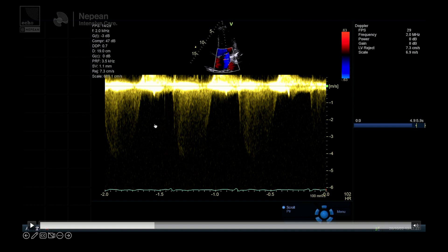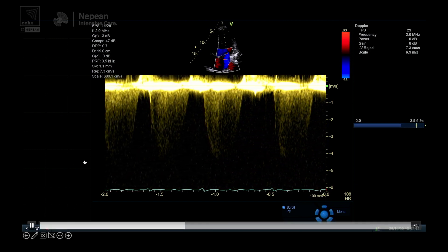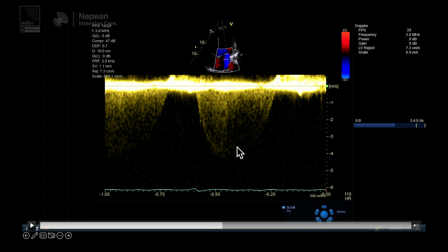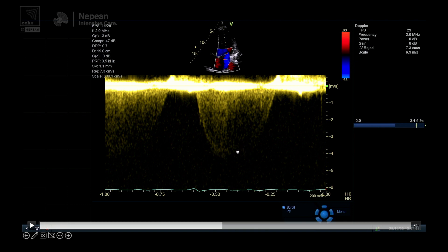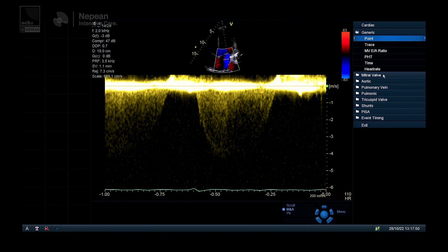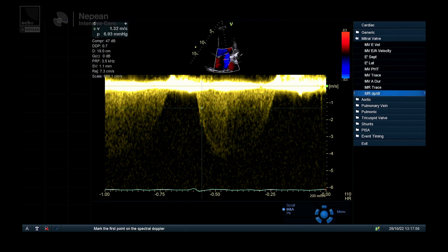I've already raised the baseline up so the negative tracing goes downwards, paused the image, and scrolled back to find a nice MR jet. This is a relatively okay jet — there's some cutoff so it's not quite optimal, but you can see quite clearly between 1 and 3 meters per second. I've also sped up the sweep speed so the single jet looks much broader, which means you're a lot more precise when measuring between 1 and 3 meters per second.